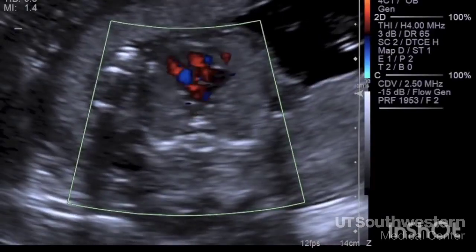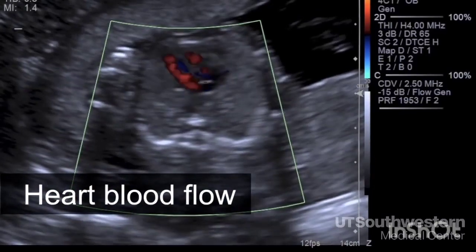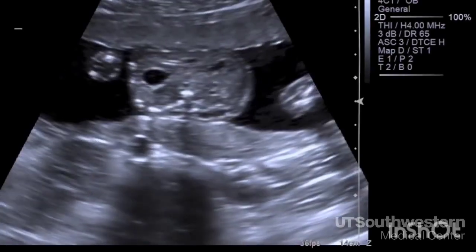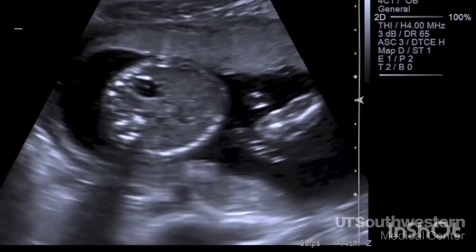These colors represent blood flow in the heart and help us to see that both sides of the heart have developed normally and are being filled with blood. The kidneys sit next to the spine and are hard for me to point out to people and show them that they're normal. Here we're looking at a cross-section of the abdomen at the level of the waist.